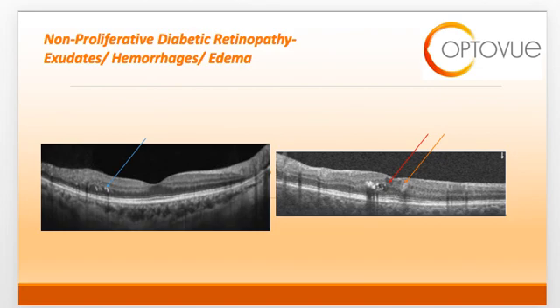The blue arrow on the left side of the slide is pointing to a cluster of exudates. We also commonly see intraretinal hemorrhages and edema. The red arrow on the right is pointing at a hyporeflective space correlating with a serous pocket of fluid, again a result of leaking blood vessels. The orange arrow is pointing to an intraretinal hemorrhage. It's important to note that both exudates and hemorrhages will appear hyperreflective on the OCT.